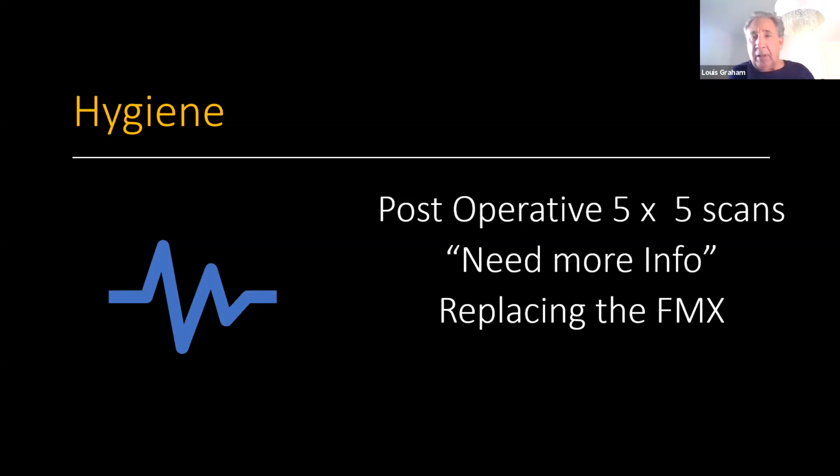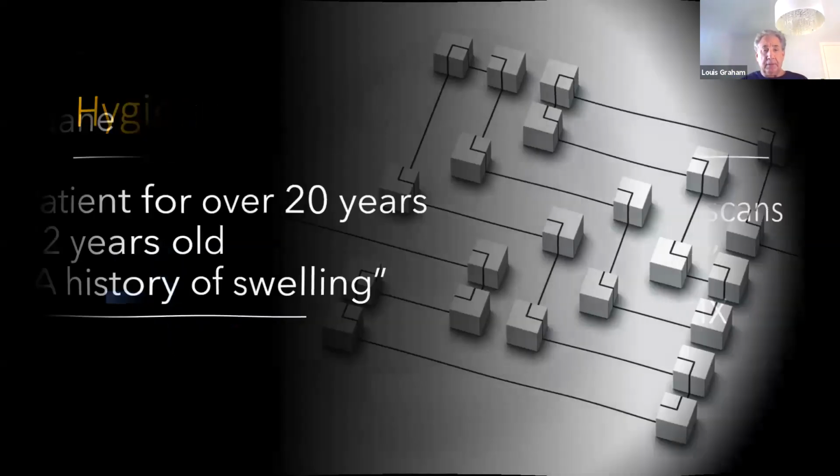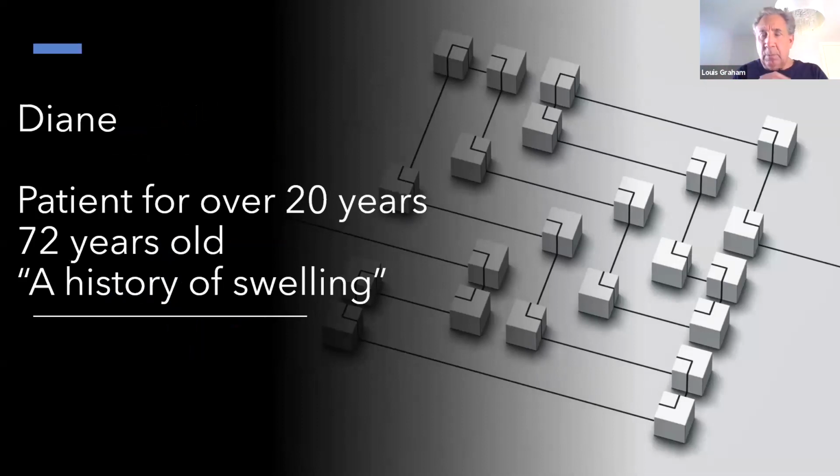So a normal hygiene appointment based on risk assessment in a 50-year-old would potentially be every 1 or 2 years vertical bitewings, and every 5 to 10 years a 10x8 or a 15x13 standard resolution cone beam. We don't take FMXs. So let's just walk you through this.